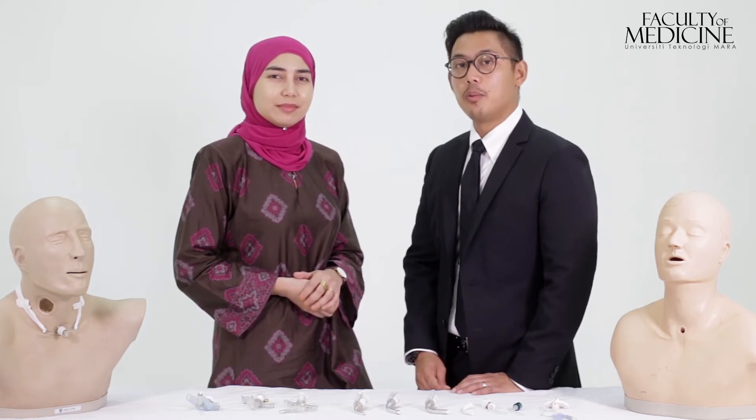Why do we stress so much on every little detail in tracheostomy care? It's because it concerns the airway, which is the first step in basic life support. So let's have a look at the common tracheostomy emergencies and how we should deal with them.